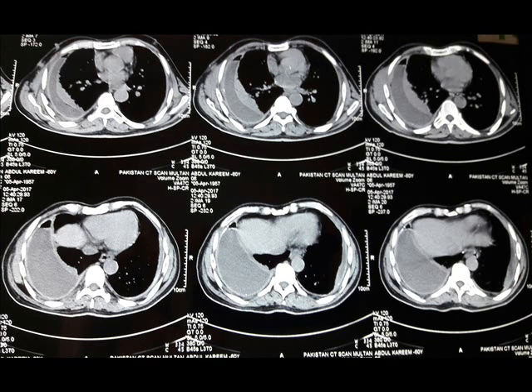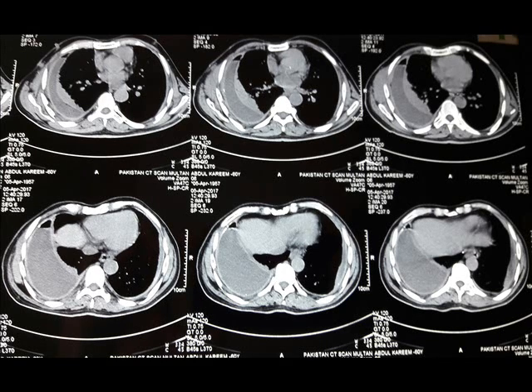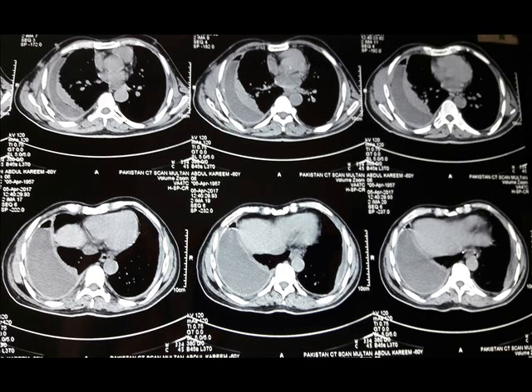The Split Pleural Sign results from fibrin coating both the parietal and visceral surfaces of the pleura, resulting in growth of blood vessels with accompanying enhancement. Both layers of pleura can then be visualized as linear regions of enhancement that come together at the margins of the collection. This is the image of a chest CT scan, and you can see the thickened visceral and parietal pleura — this is called the Split Pleural Sign.